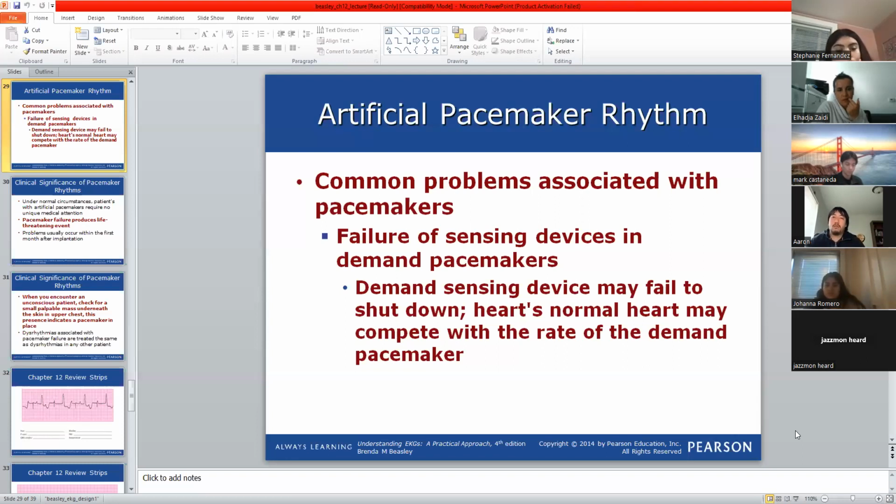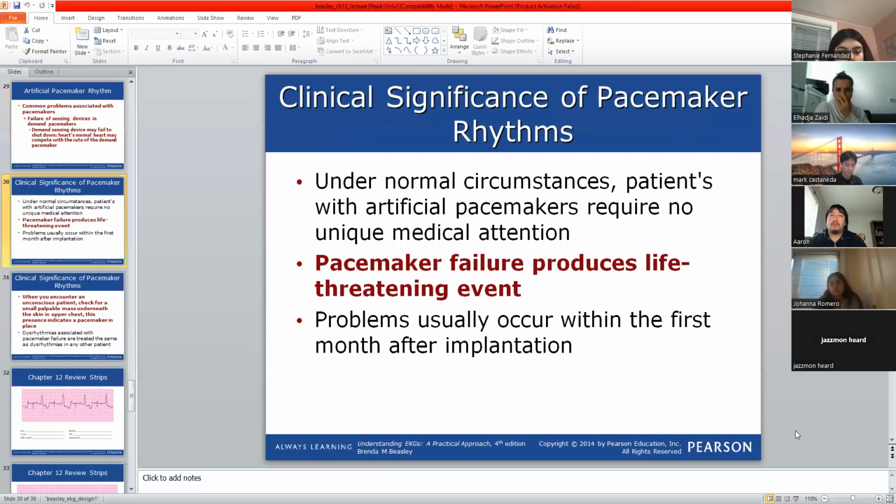So it has to be working. Now also the pacemaker is not sensing that the heart rate is low. Actually, this is only in the case of a demand pacemaker, but the preset or asynchronous one will work by itself, with no need to sense if the heart rate has dropped.